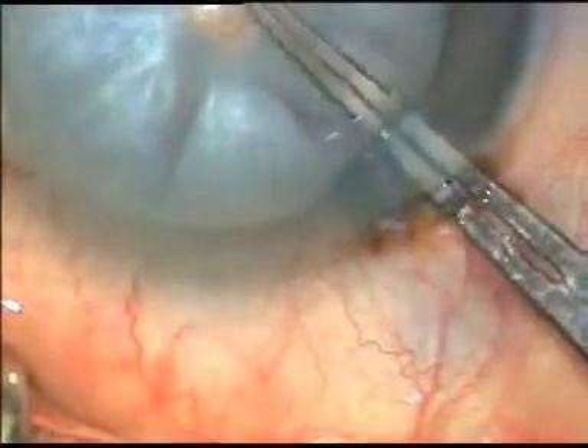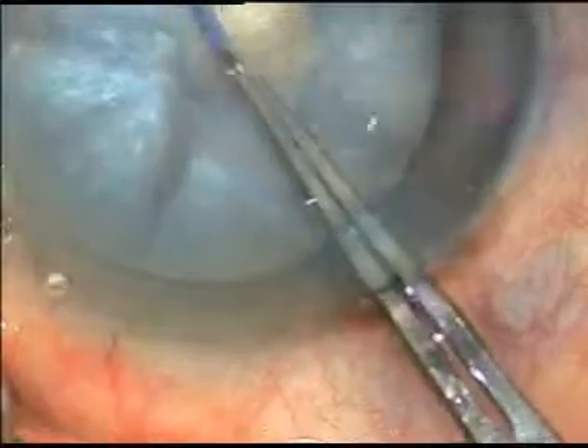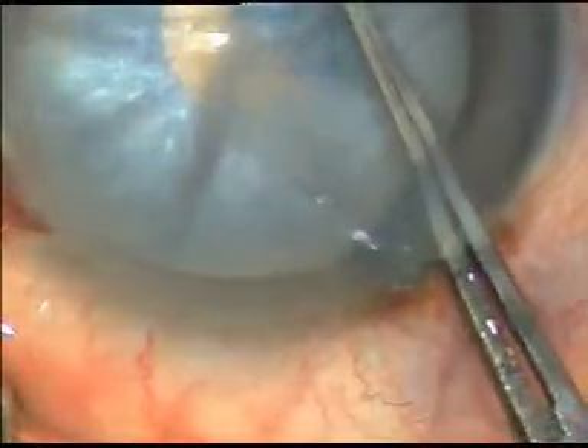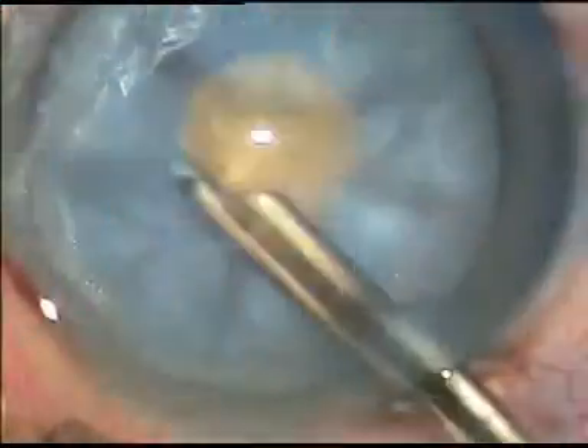Now, with the help of utrata forceps, a small rhexis is done right at the anterior pole of the intumescent cataract.